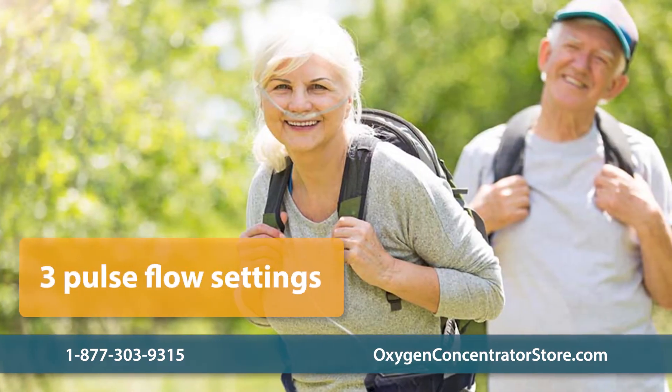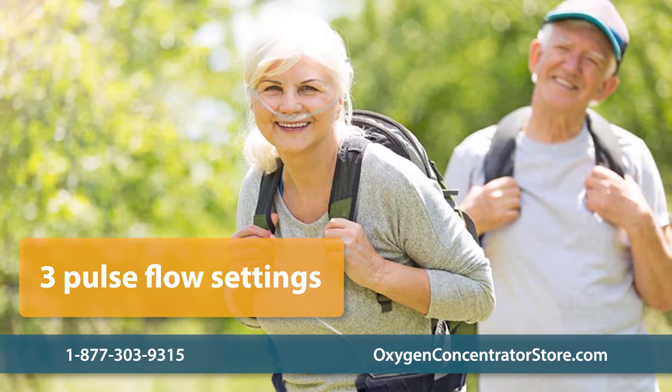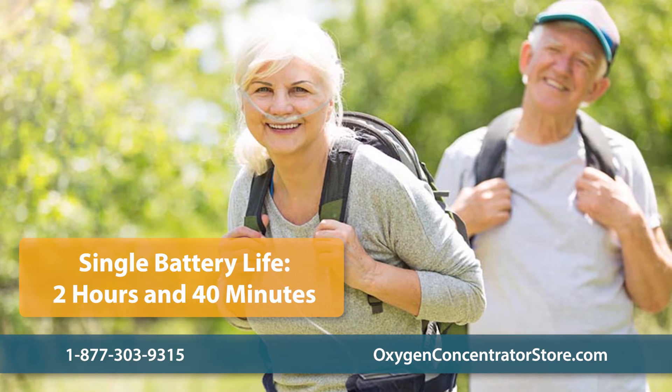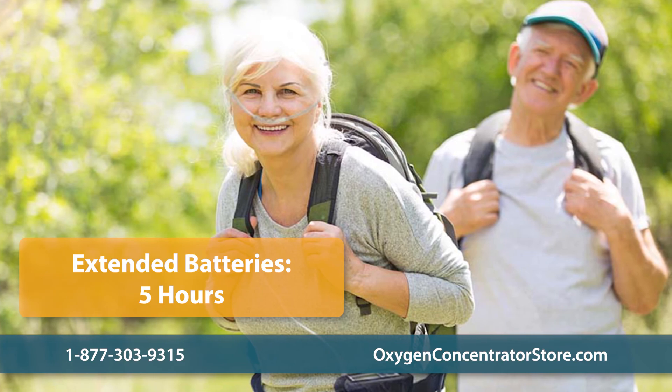The G4 unit features three pulse flow settings and is designed for both active and daily use. A single battery can last up to 2 hours and 40 minutes on a setting of 1, and an extended battery can last up to 5 hours on a setting of 1.